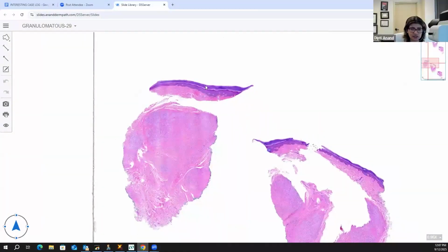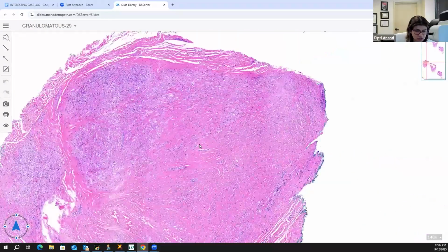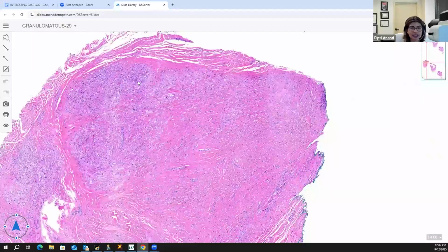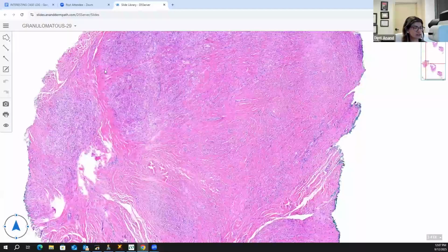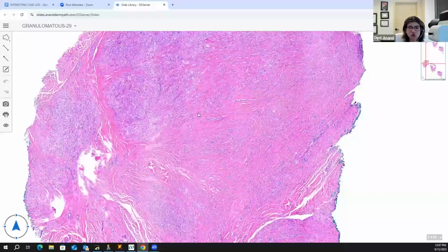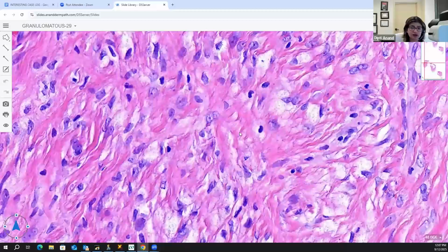You often see them in thick skin biopsies, the elbows or the knees, or not really the knees, but you get the point. The older they get, they will develop these fibrous septae and they will have this multinodular appearance. And when you go up on high power, you see the nice foamy xanthomatized cells. So they can mimic granular cell tumor.